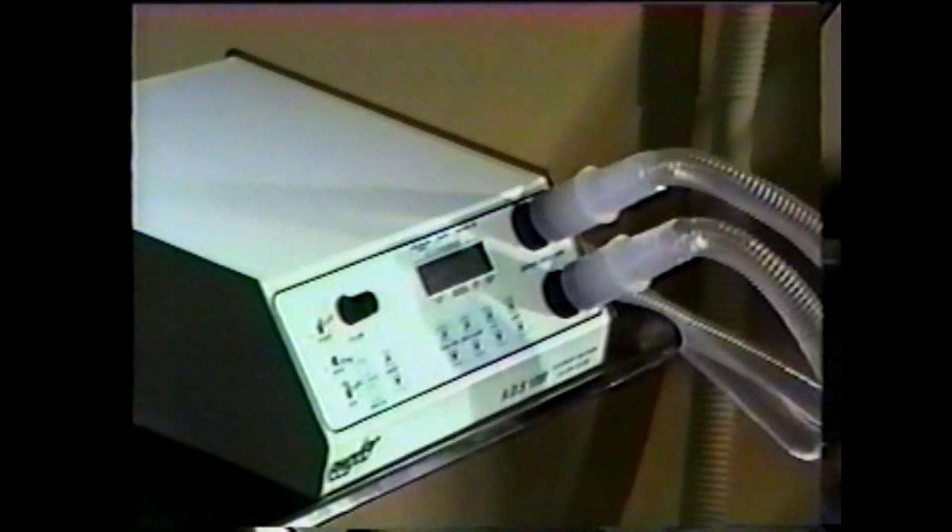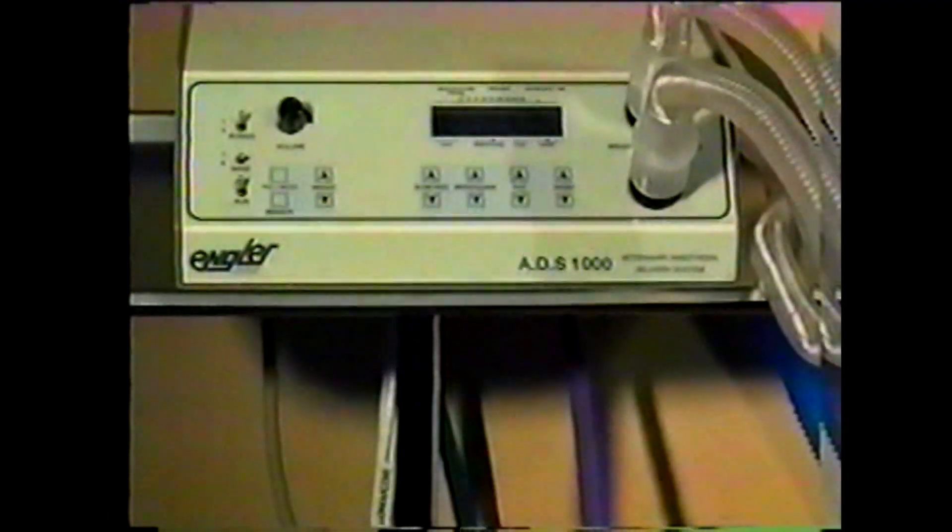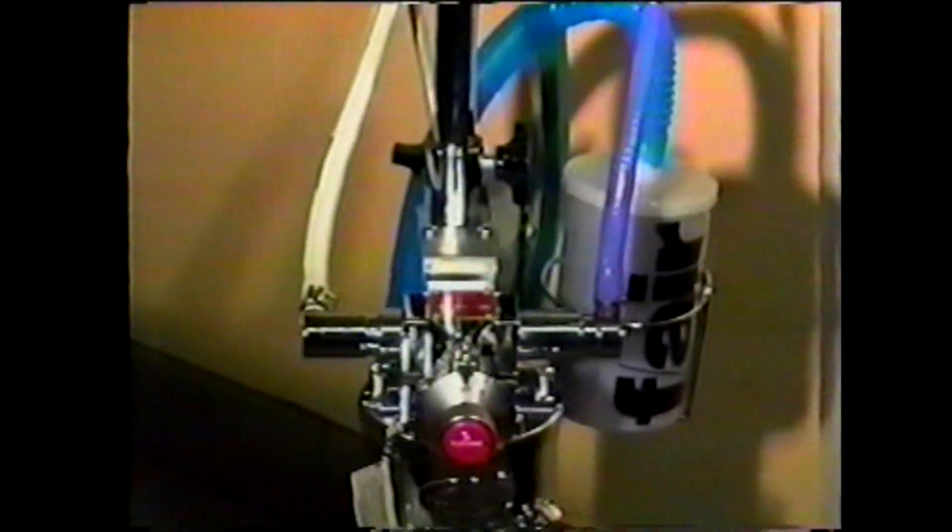The ADS-1000 is the first microprocessor-controlled anesthesia delivery system designed specifically for veterinary use. The ADS is compact, efficient, and user-friendly, and allows a veterinarian to focus on the surgical procedure while the ADS safely controls ventilation and anesthesia delivery.